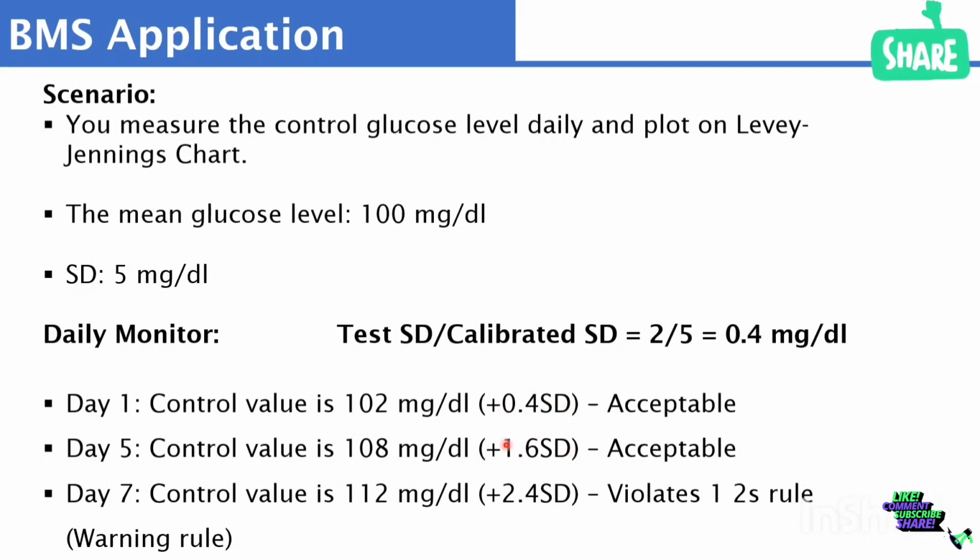That will give you 1.6. So you can see that this 1.6 is less than 2 SD. Remember that for us to have 2 SD added here, this has to be 110. Do you understand me? But because it's 108, that means the test is 8. It means then that it is less than 2 SD. And of course, if you do the mathematics, you are getting 1 more SD, like I've said. So these two are acceptable.